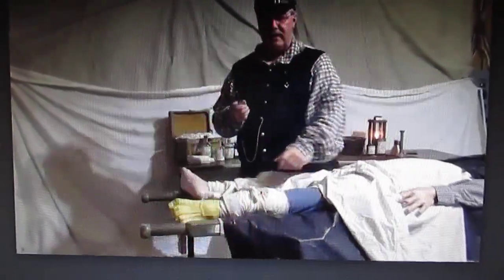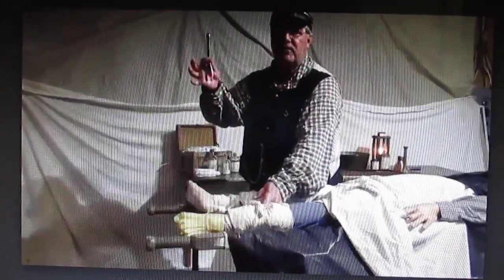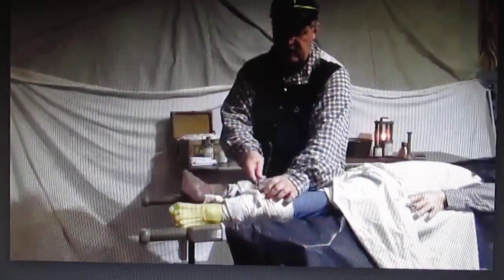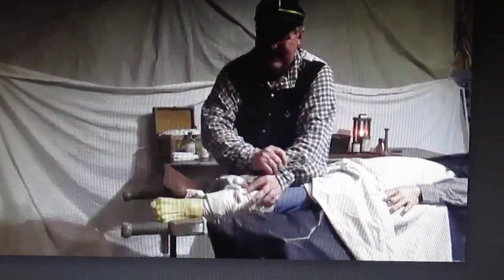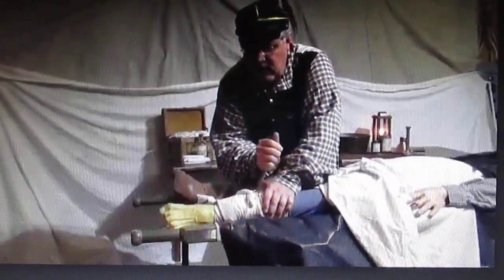Now the next step is to remove whatever is in there, and I have stuck my finger in because that is the best probe for a doctor. It's connected to a brain. So I have a bullet extractor here. I'm going to see if I can find out what's in there. I know there's a piece of lead. So I'm going to stick it in there, and I'm going to see how I can pull it out of there. And whatever's in there, the muscle has definitely tightened on it. There we go.